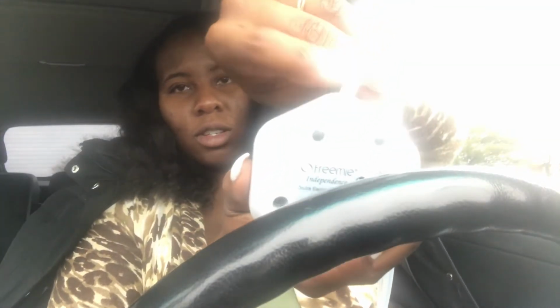Now, there is a little part on the back where you can have a clip. I have lost my clip. Let's see if I can show. It's hard to see, but there's a spot on the back of the motor itself where you can clip it to your jeans or your purse or whatnot. You could stick it in your pocket. My only concern with doing that is like how my tube just fell apart. You can end up knocking your tube out. I think that's probably one of the most annoying things about this pump, honestly, is the tubes. Which is why it's not my absolute favorite wearable pump, but it is a really good pump.